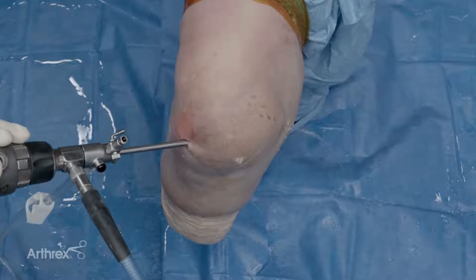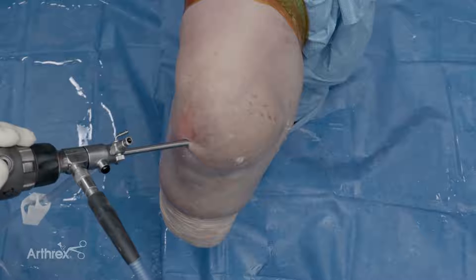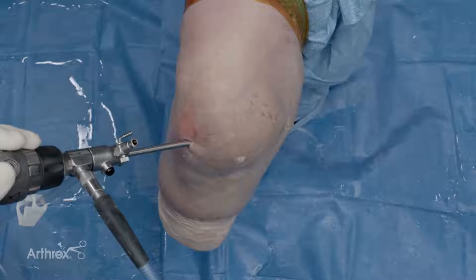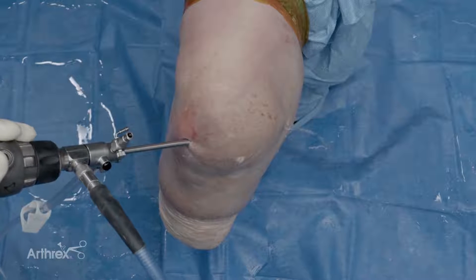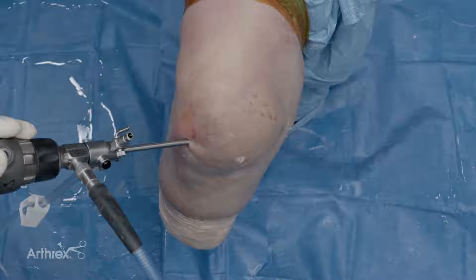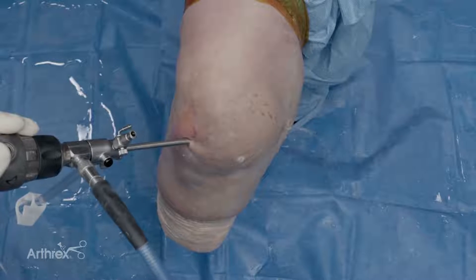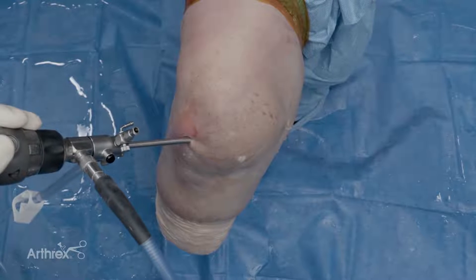Hello, I'm Summer Hamoud. I'm coming from the Rothman Orthopedic Institute in Philadelphia. Today I'm going to show you how to do a perfect meniscal repair. Specifically, we're going to be working on the medial meniscus, as it tends to be the more challenging meniscal repair. I'm going to show you how to use the fiber stitch implant to get sequential vertical mattress stitches that mimic an inside-out repair on both the femoral and tibial sides, and how to do this with ease.